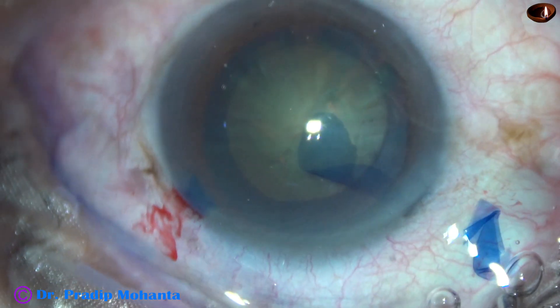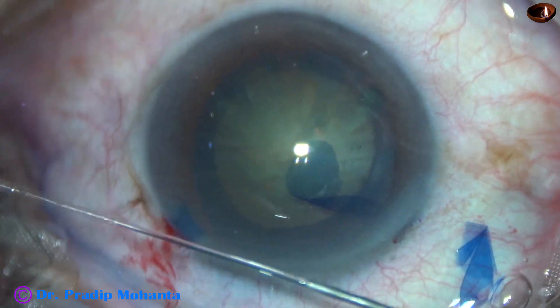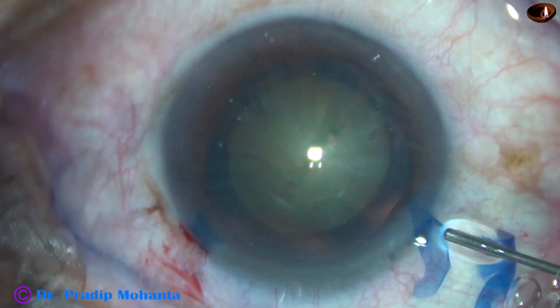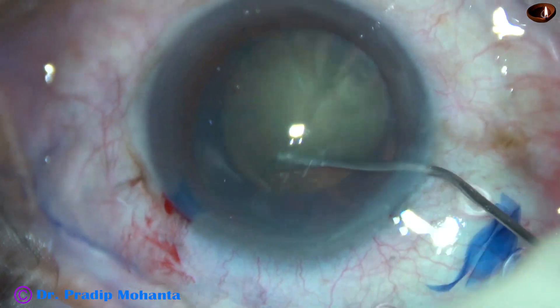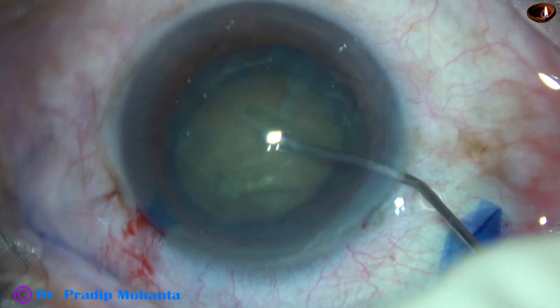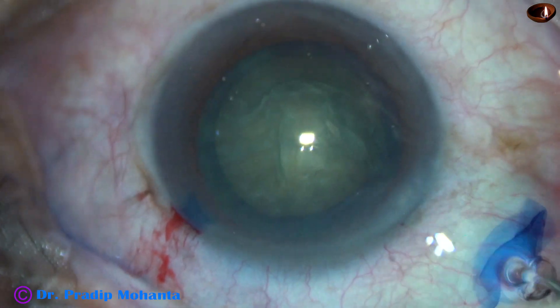Hydrodissection is done using a 23-gauge cannula and BSS. The nucleus is tapped and the nucleus is rotated.